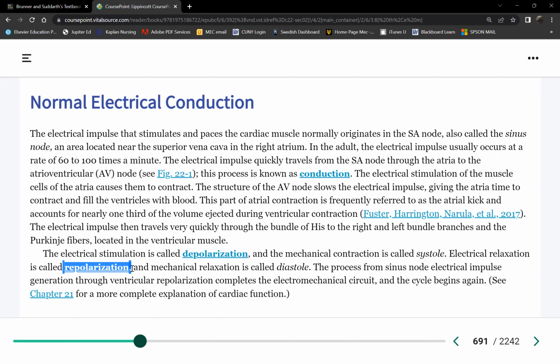The reason why we do not defibrillate asystole, what is asystole? Flat line. So when it's flat line, that means what? Is there any electrical activity? None. So therefore, can you shock something if there is no rhythm? No, because if you shock them, you're simply cooking the patient. You are electrocuting the patient.